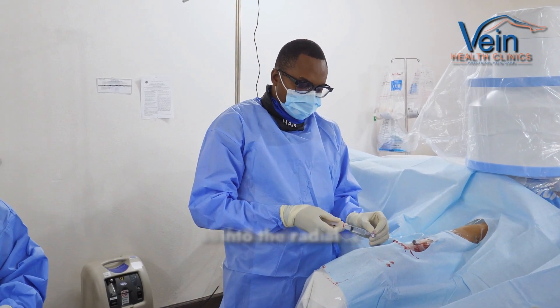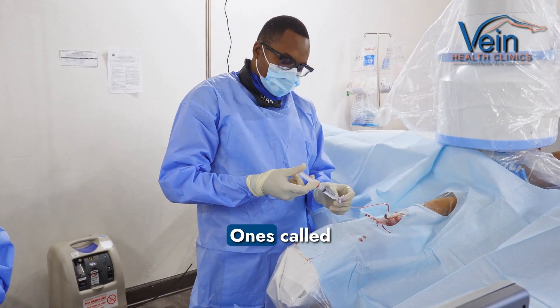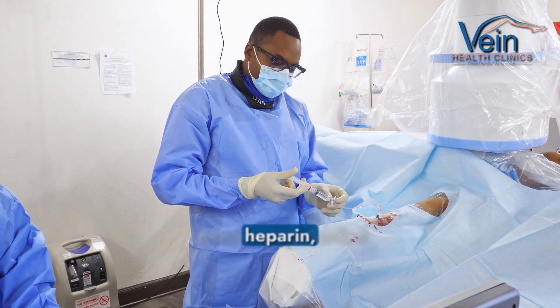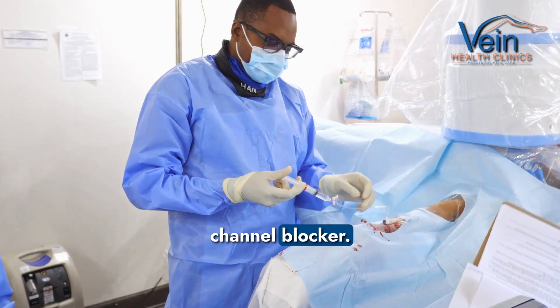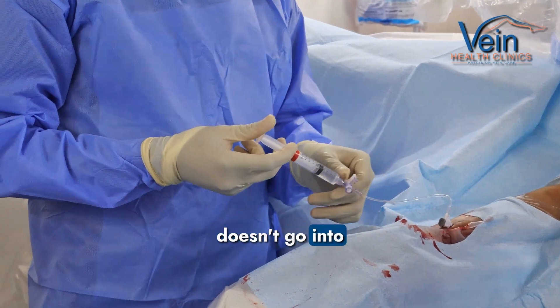Following access into the radial artery, we do inject some medicines. One's called nitroglycerin, another one's called papaverine, and then a calcium channel blocker. And what that helps us do is dilate that radial artery, which is a small artery, and make sure it doesn't go into spasm.